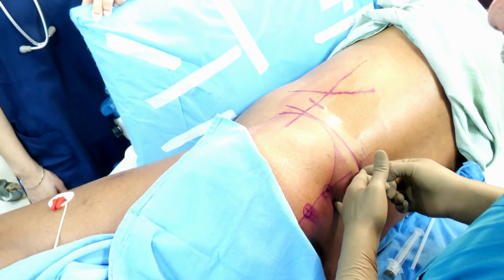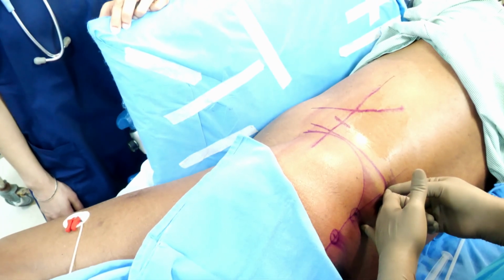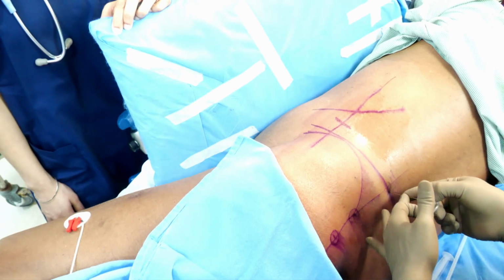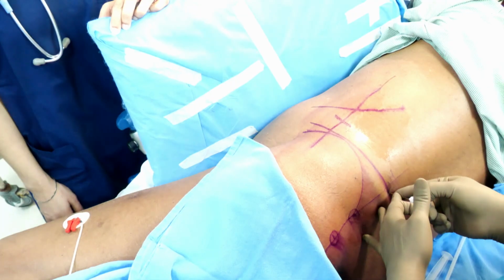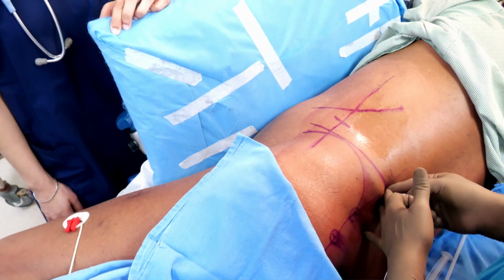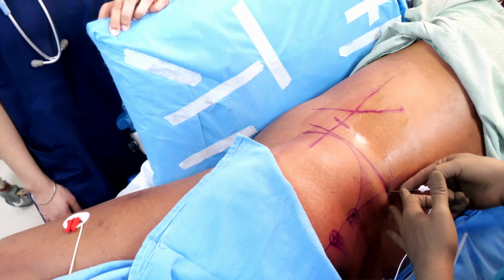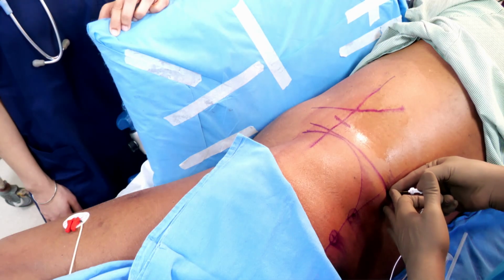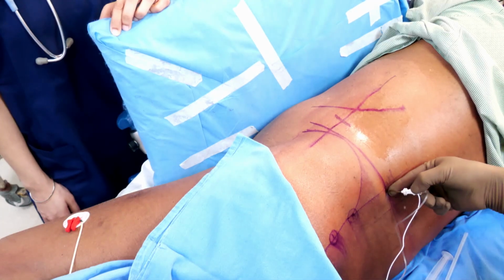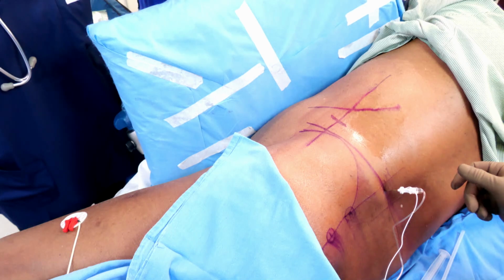The Capdevilla approach is actually closer to the lumbar plexus. Sometimes the lumbar plexus falls totally on the lumbar vertebral body. In geriatric patients, you have got an atrophic psoas major, and that's why you don't get those visible contractions, because the lumbar plexus falls away from the approaching needle. Increase the current, please. Yeah, that should be fine. One should be fine.